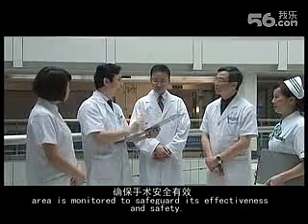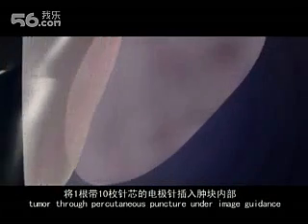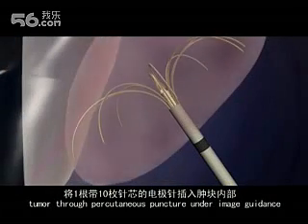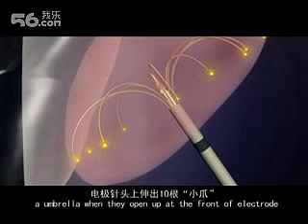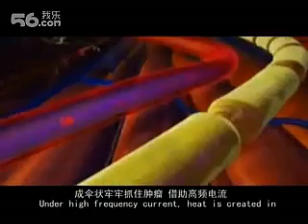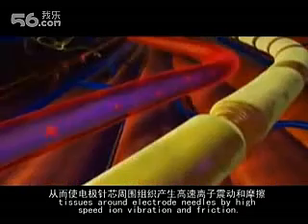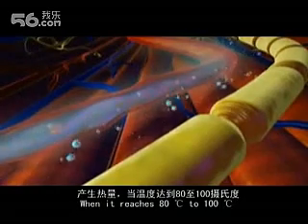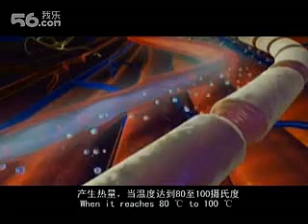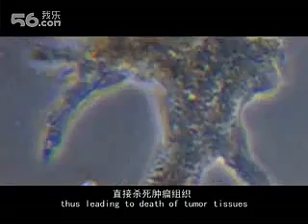One electrode with 10 needles is placed into a tumor through percutaneous puncture under image guidance. The 10 needles in the electrode will hold the tumor firmly like an umbrella when they open up at the front of the electrode. High-frequency current heat is created in tissues around the electrode needles by high-speed ion vibration and friction.